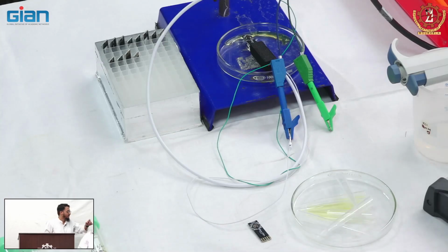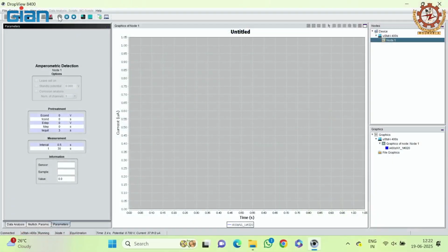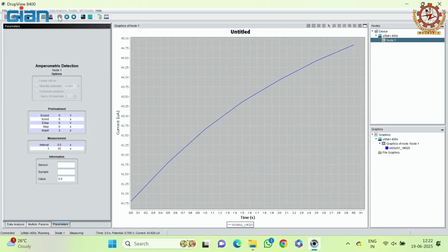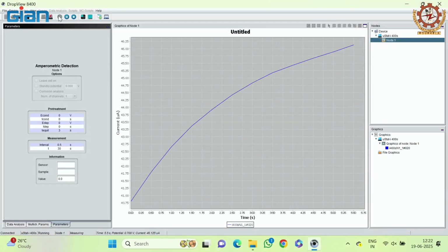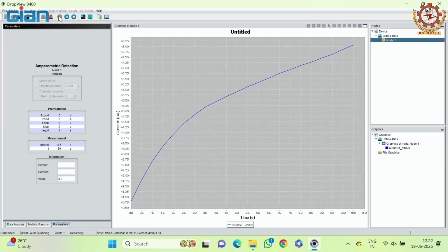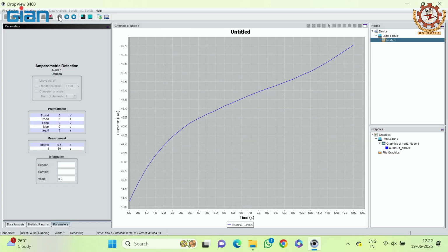So can you show the screen? The experiment is being shown. So you can see there are no counter electrodes. There is no platinum counter electrode. We are going to use the counter electrode on the PCB. Okay, you can start. You can switch to the laptop. Starting now. So at the end, we will actually look at the current values. You can please note the current value. This is for 30 seconds, right?